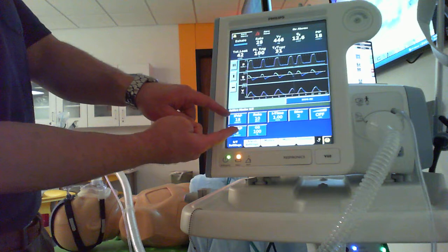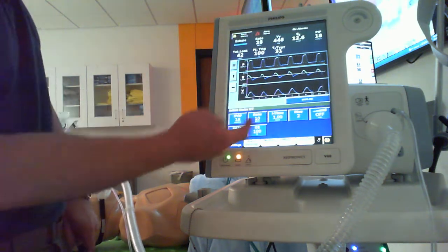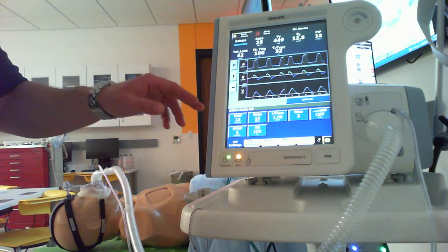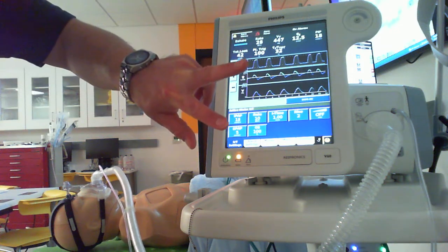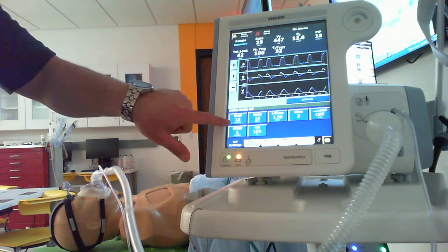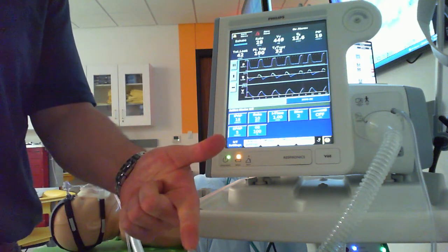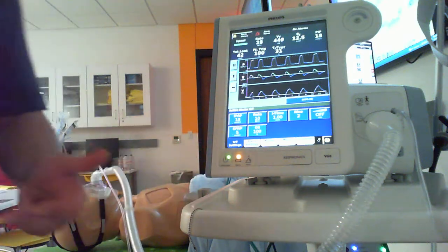Think about this now. My current pressure support, if I do IPAP minus EPAP, is 13. You can hit the button and it also calculates that for you. If I started increasing my baseline pressure to improve oxygenation, you got to think about what that does to my pressure support. Both IPAP and EPAP are set independently. As I bring those closer together, all right, I just messed up my pressure support. Well, what's my pressure support setting responsible for? Work of breathing, tidal volume, CO2 elimination, all right? All these things, it can have an effect on my respiratory rate.